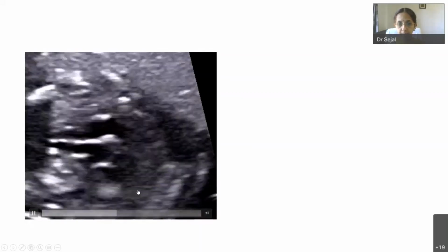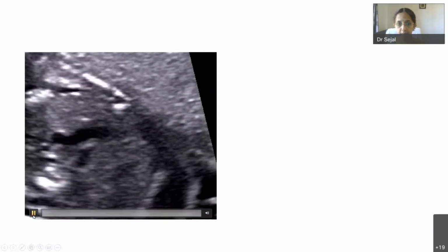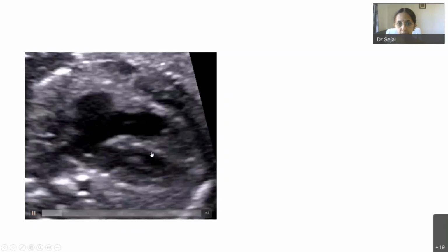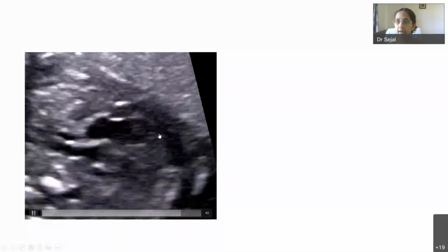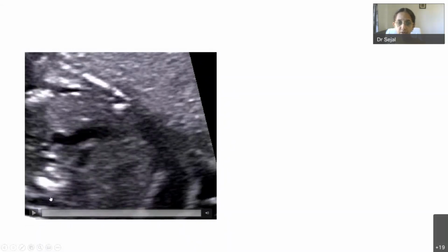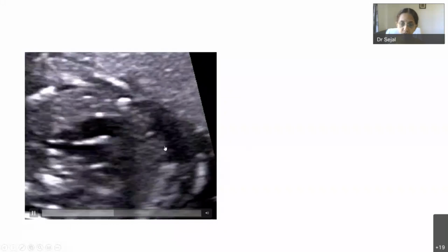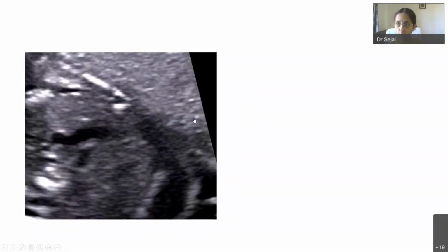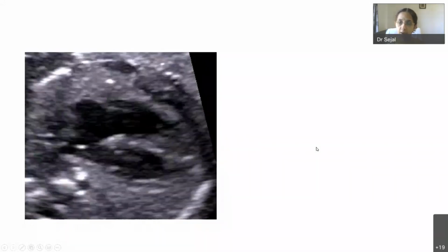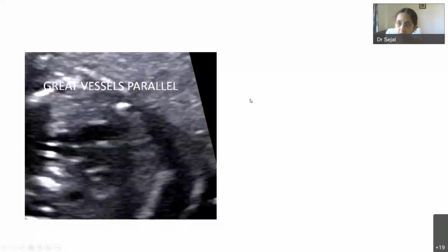See, this is a typical slipper-shaped left ventricle. The left ventricle is giving rise to one vessel which is clearly bifurcating, and the right ventricle to another vessel which is going straight. The second thing is the arteries are not crossing. So this diagnosis is usually not very difficult. One, because arteries are not crossing, and second, because you have a bifurcating vessel coming from the left ventricle.